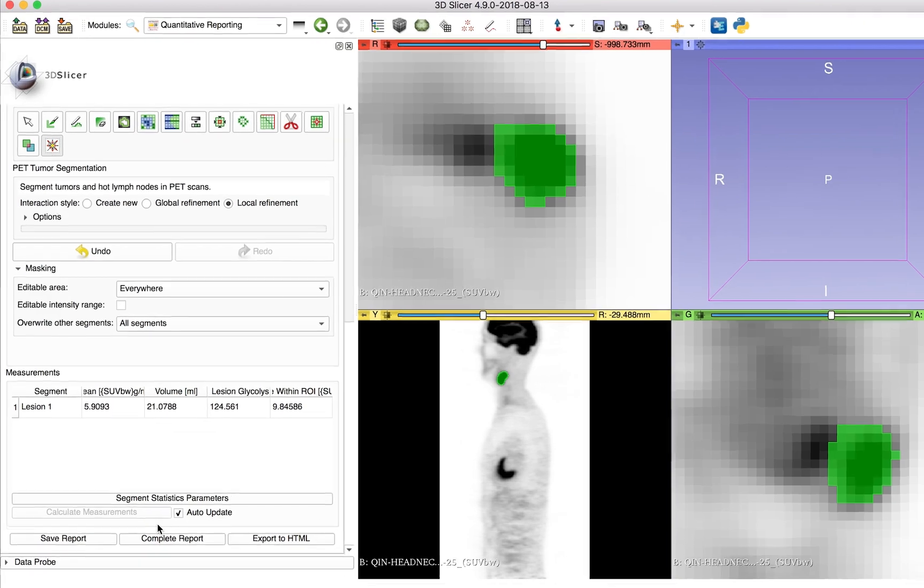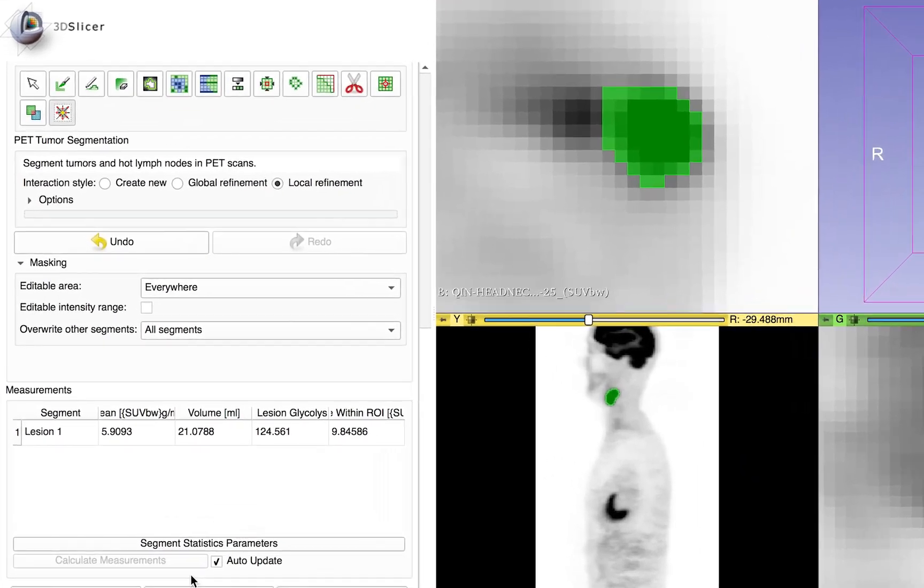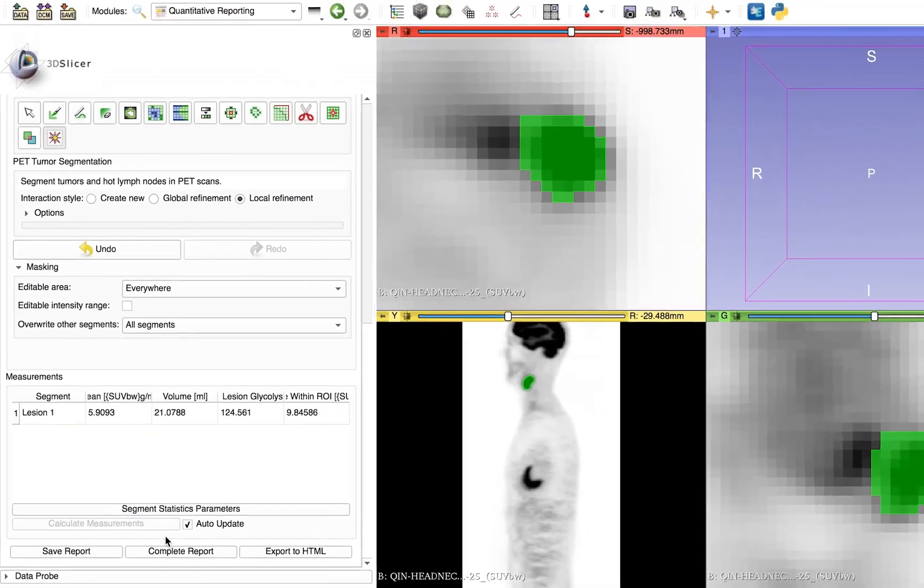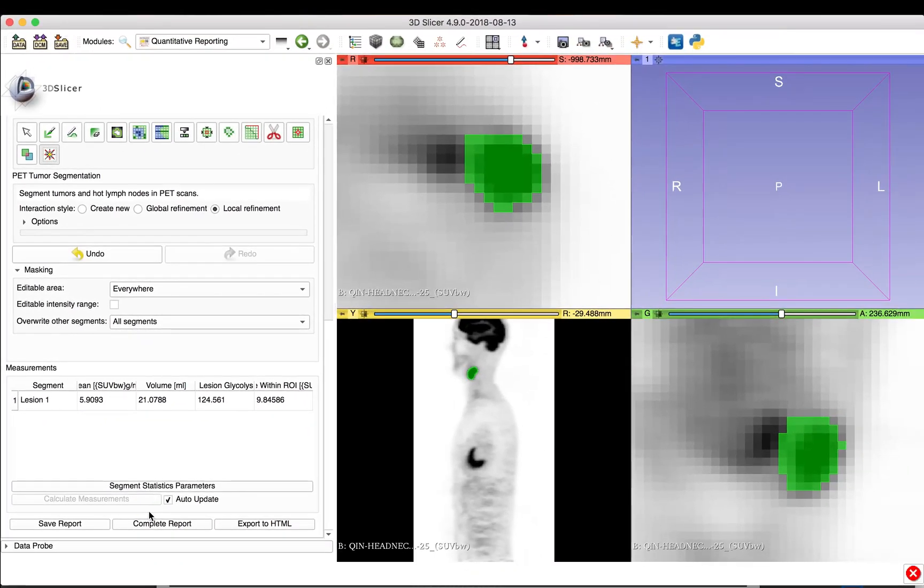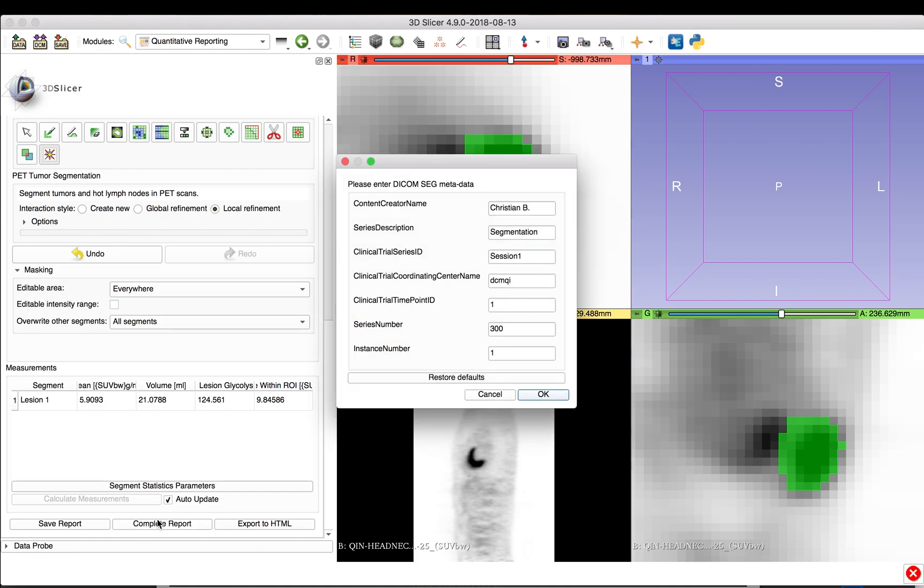Once we have segmented all lesions, assigned them proper codes, and calculated the quantitative indices of interest, we can export the results as DICOM SEG and SR files to the DICOM database. Clicking on Complete Report asks for additional metadata for the DICOM reports. Here, for example, we can enter observer's name, then click Enter to complete the process.